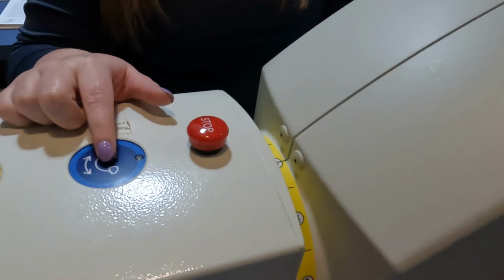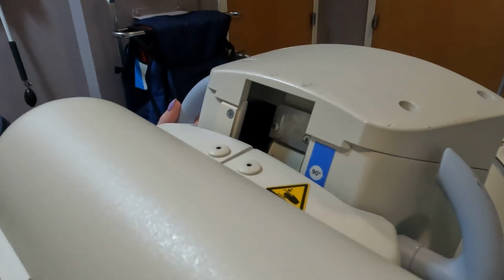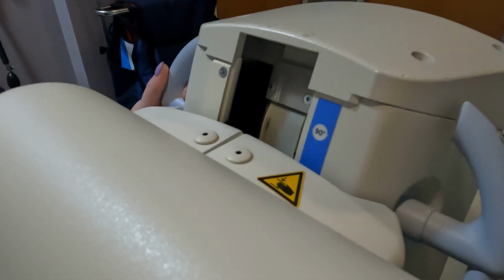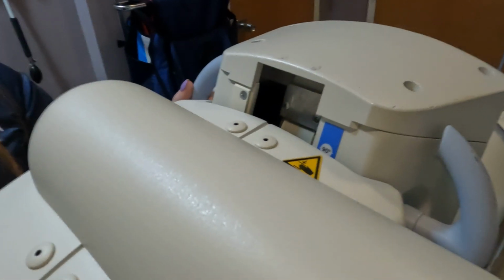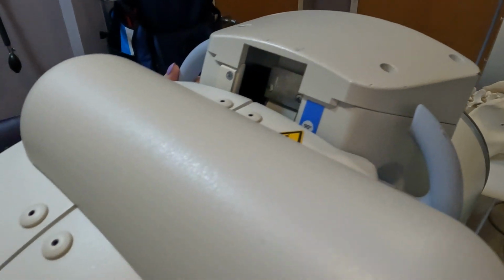One thing to notice with lateral, so if you go into lateral, 90 degrees is here, not here. The reason that this C-arm goes past 90 degrees is for the spin, because they need a little bit of the overlap to make that spin. So that's a little trick about the lateral.